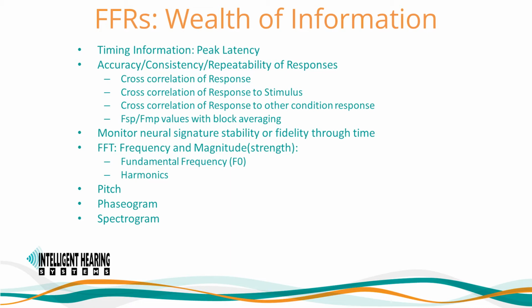Researchers acquiring using the block averaging feature can obtain FSP and FMP values. You can also monitor neural signature stability or fidelity through time. The FFR is different for each person but should remain consistent through time. Thus, monitoring for changes or differences in time can provide beneficial information.